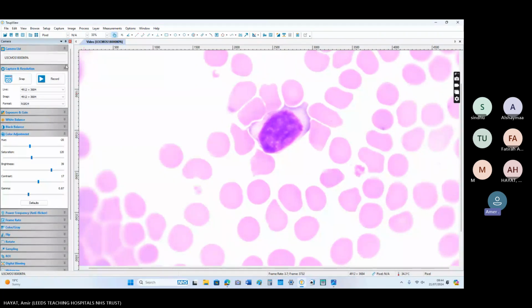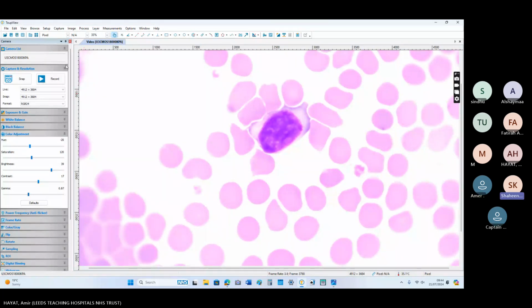And then the third question would be, what is the most likely diagnosis here, given the patient's age and presentation? That is EBV-induced viral infection, most likely infectious mononucleosis. Yes, because the patient only presented with fever and few lymph nodes. They did not mention any B symptoms, and the blood film does not show any immature blast. And there is scalloping around the RBC, which is a feature of reactive lymphocytes, and they are basophilic as well. There are no nucleoli inside.